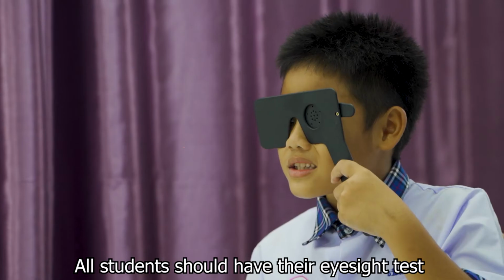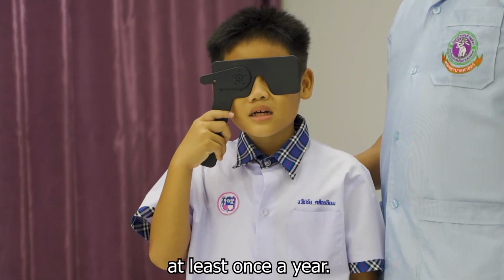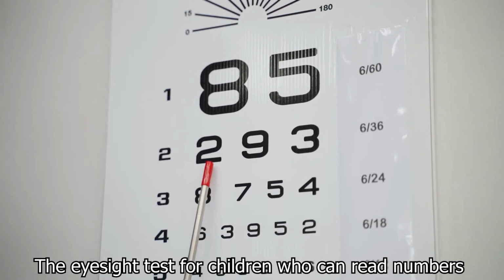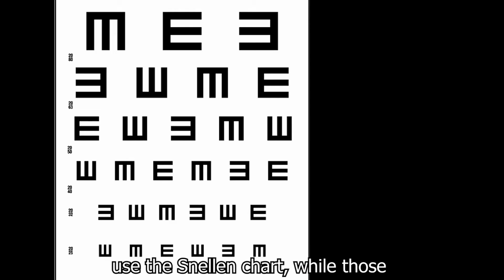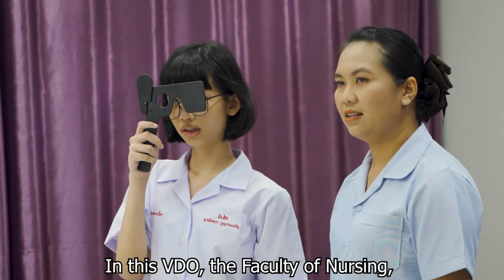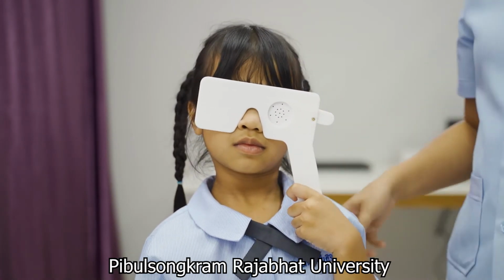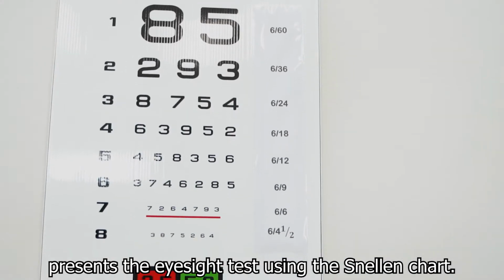Part 2. Equipment preparation. All students should have their eyesight test at least once a year. The eyesight test for children who can read numbers uses the Snellen chart, while for those who can't read numbers, the E-chart is used. In this video, the Faculty of Nursing, Pibulsongkram Rajabhat University, presents the eyesight test using the Snellen chart.